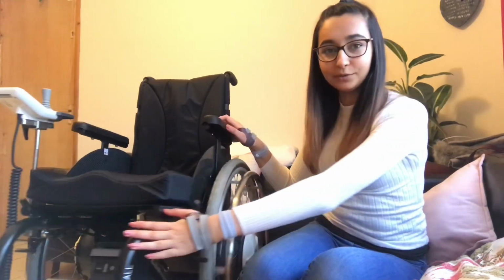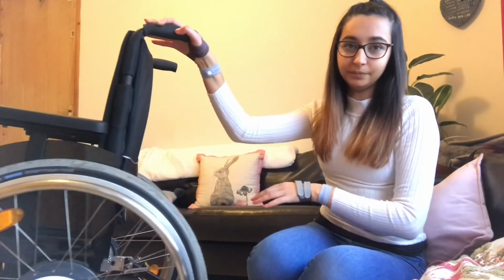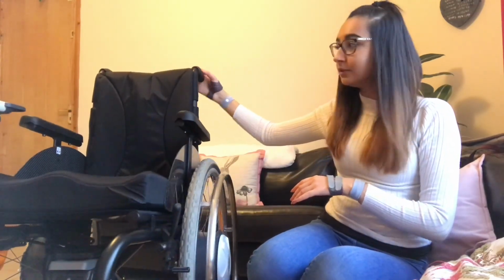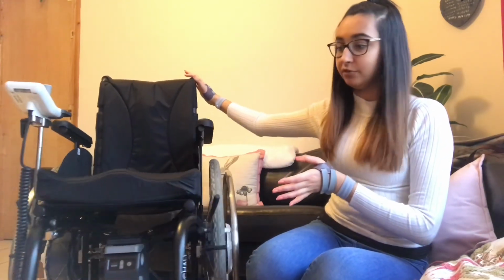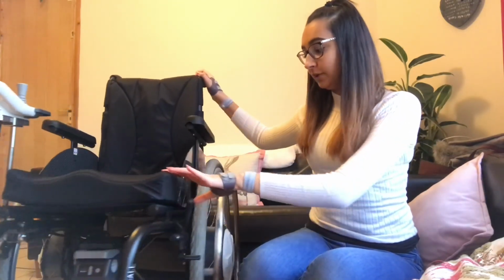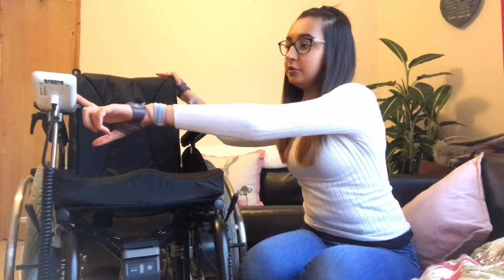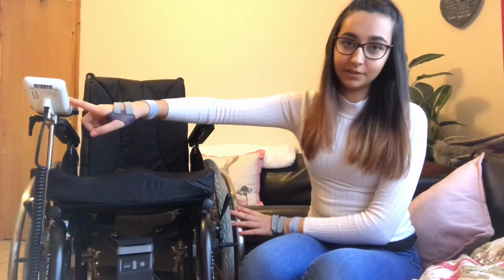So I will do a bit of a spin so you can see the wheelchair a little bit more, but it does look kind of similar to the other one, just with a higher back. It folds, which is a great improvement, and then obviously it has a different power assist. But really, I just really like it. And other than the joystick there, it is sort of like a manual chair. It looks like a manual chair just with a stick, which was a nice combination for me.